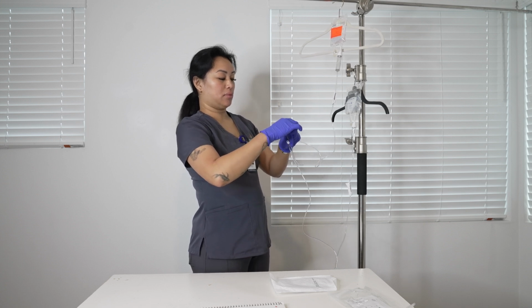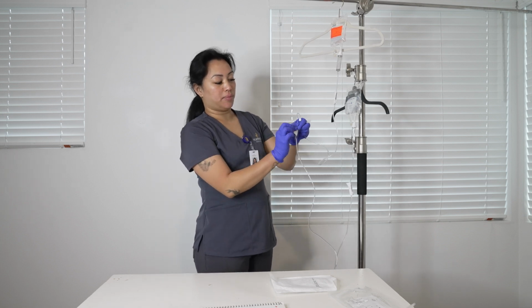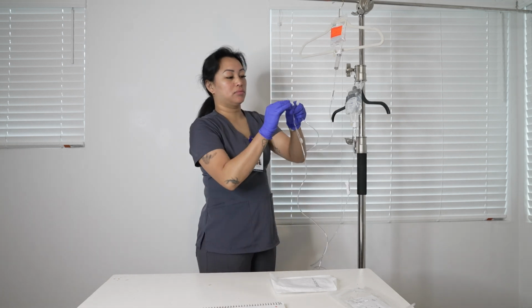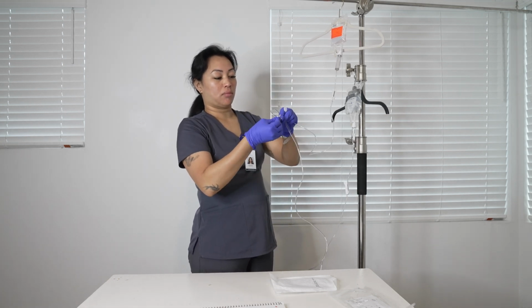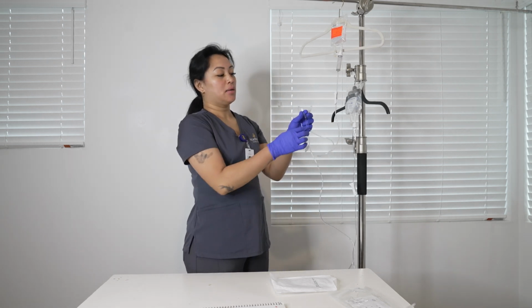How about put the cap back on, and then I will alcohol the Y port. Now we are going to let that air dry.